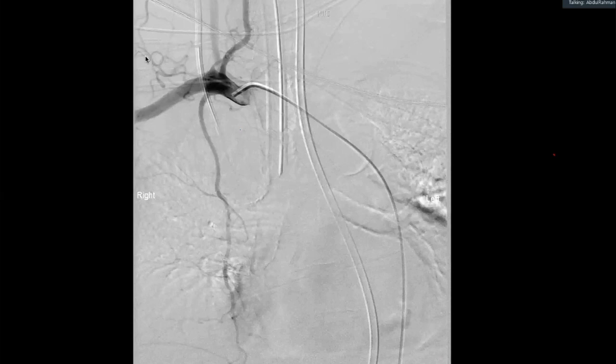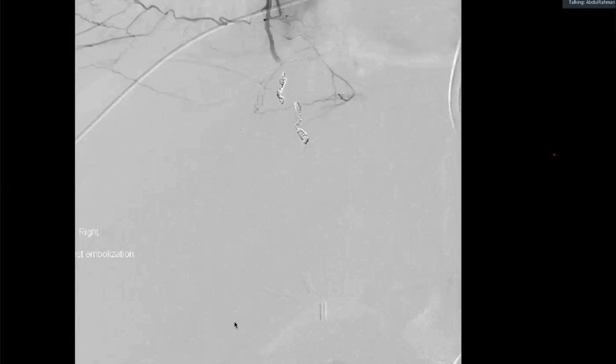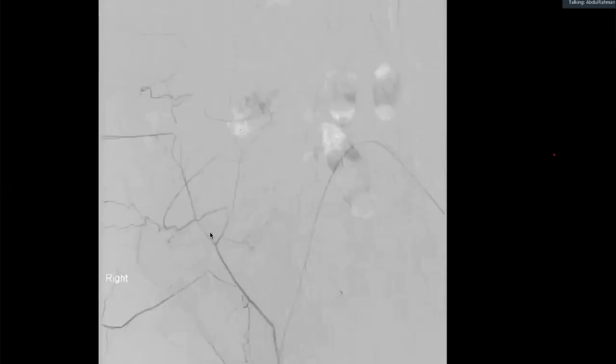What you need to do is step back and have a look at the film. Don't focus on the arteries. See what's around them. This is how we identify, in interventional radiology. You can see the lungs. You can just about see some ribs here, but the trachea gives it away. So this is the bleeder. It was bleeding from the internal mammary artery. Here's active bleeding, and then this is embolized with a couple of coils. And just to finish the picture, we then did an angiogram of the inferior epigastric artery. There's no evidence of bleeding.